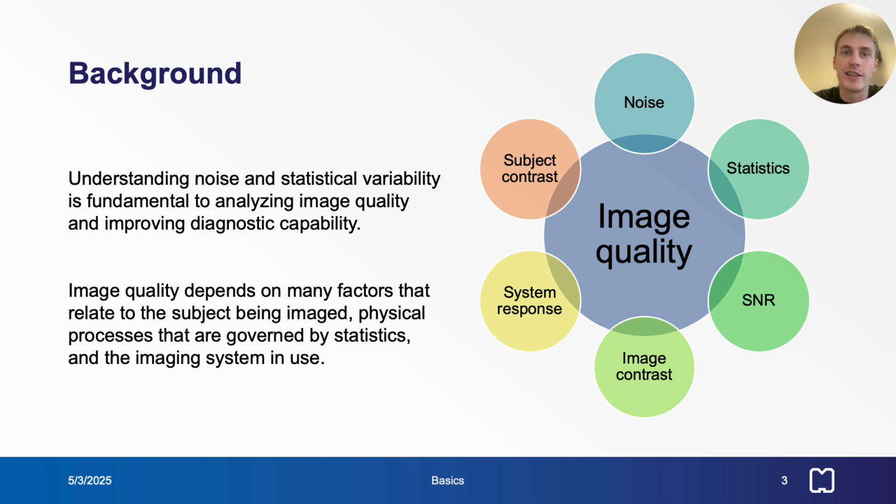Understanding noise and statistical variability is fundamental to analyzing image quality, which in turn can improve diagnostic capability. The image quality depends on many factors, including the object or subject being imaged, the physical processes that are governed by statistics, as well as the imaging system in use.